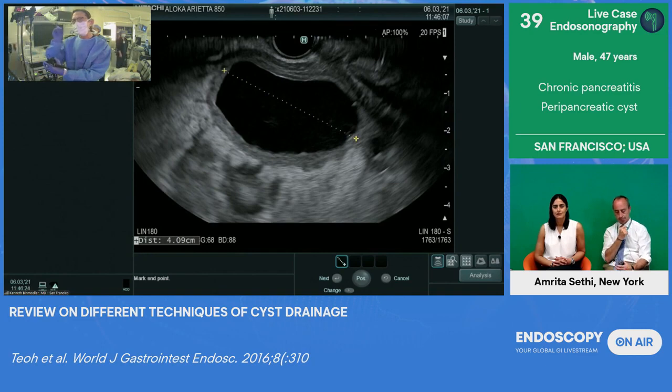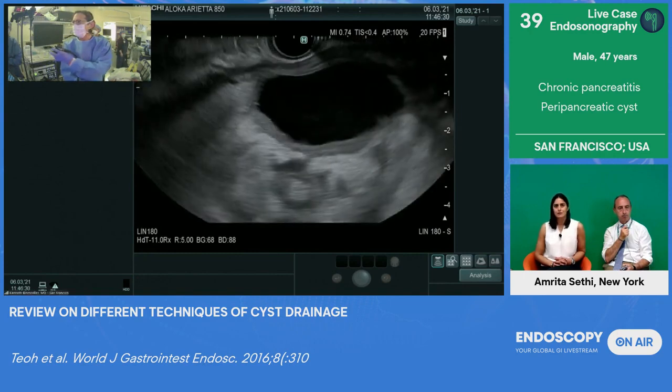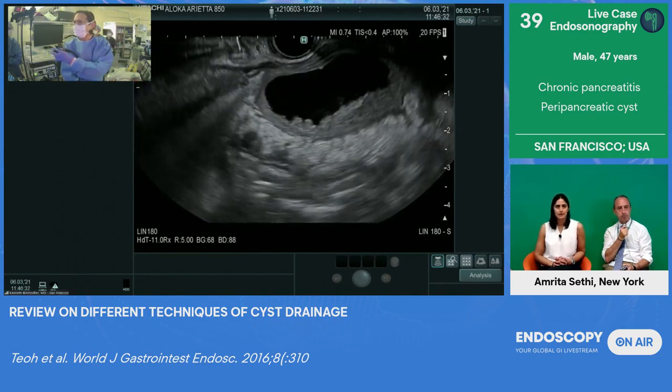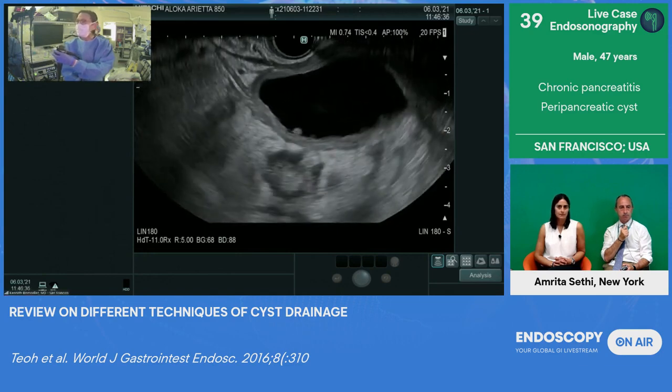I'm having a little difficulty understanding you. I apologize. Can you repeat that? So what do you think of the wall that is there? It looks quite thick. Yes. It is thick. It is thick.